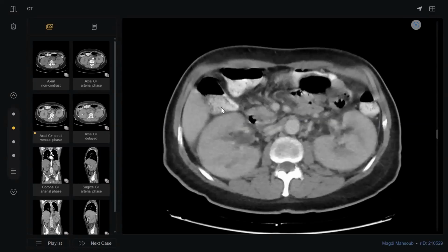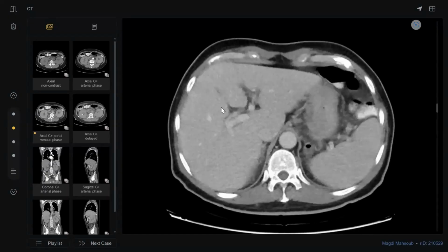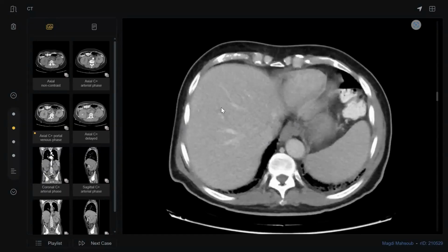Differential diagnosis like what? Number one, lymphoma. Number two, nephroblastomatosis. If you tell the examiner like this, you are brilliant. But tell the examiner, doctor, I want to search for any enlarged lymph node.